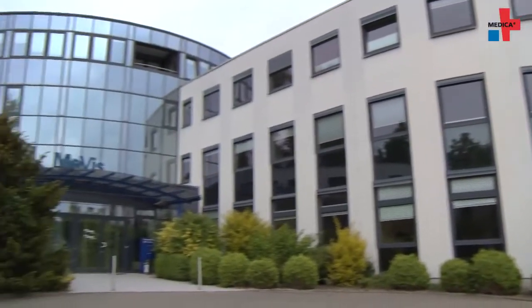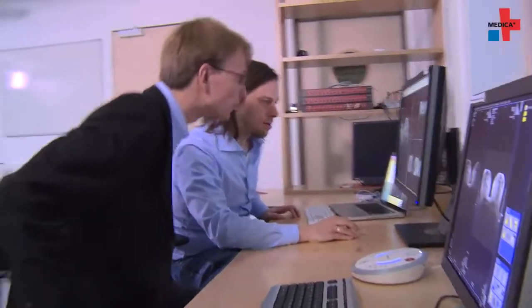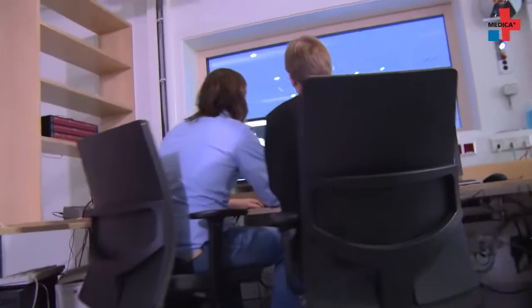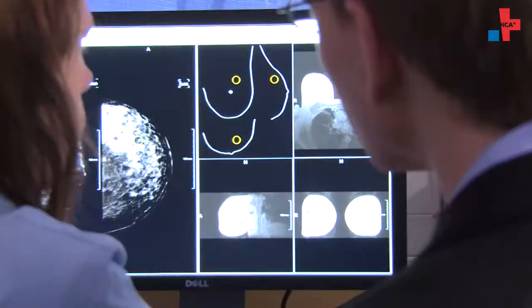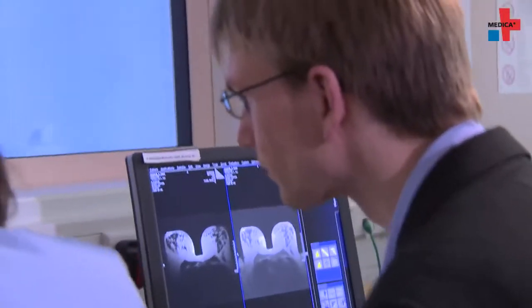Researchers at the Fraunhofer MEVIS have focused on breast imaging for many years. During the Bridge development, they initially started with mammogram images and then expanded the software with 3D ultrasound and MRI data. To put this into practice as quickly as possible, the scientists utilize different skills. Dr. Joachim Georgi oversees this project as an information scientist.